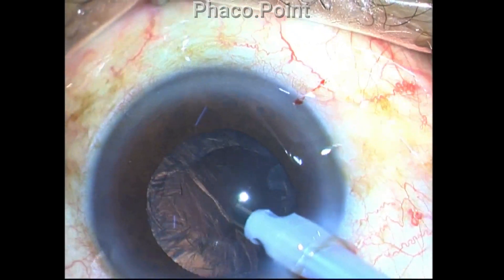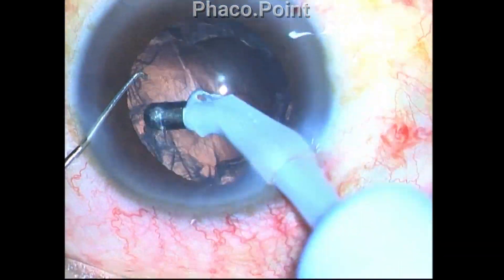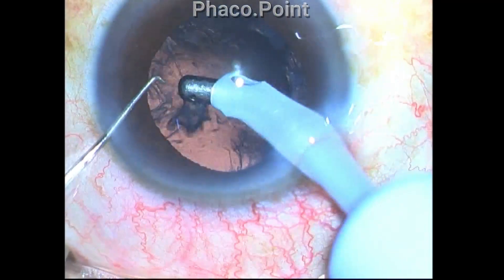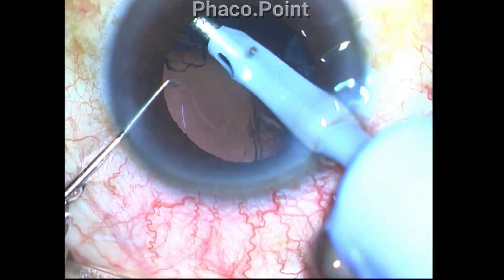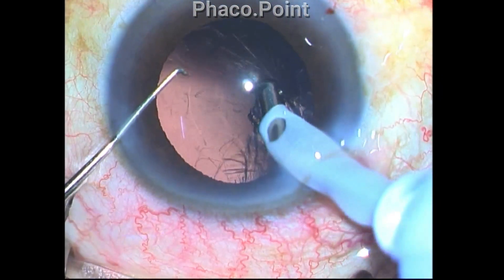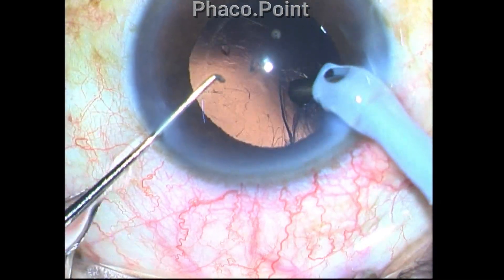The phaco emulsification of the nucleus is now completely performed, and you can see that what is left behind is a little bit of cortex. I remove this cortex with my coaxial IA probe and everything is moving ship-shape and smoothly up to now, when I suddenly catch the posterior capsule.